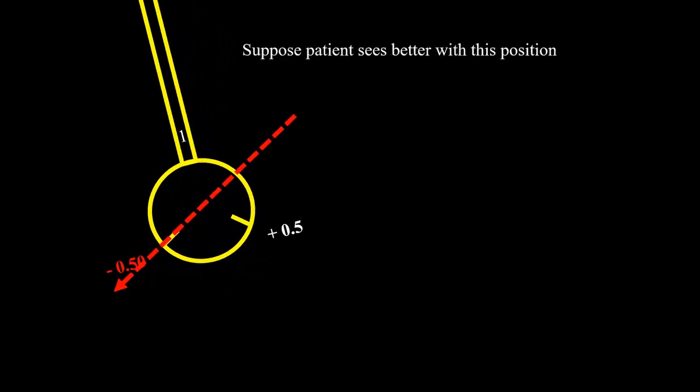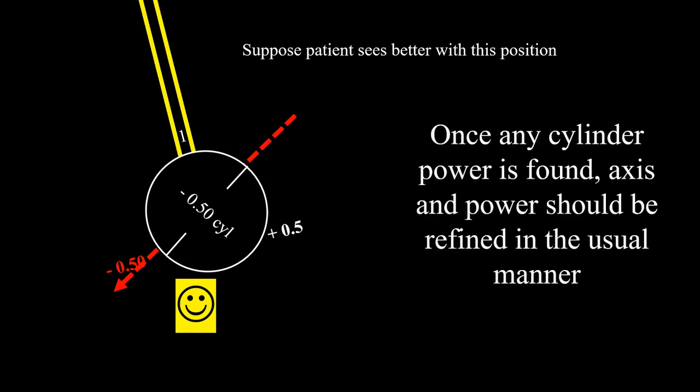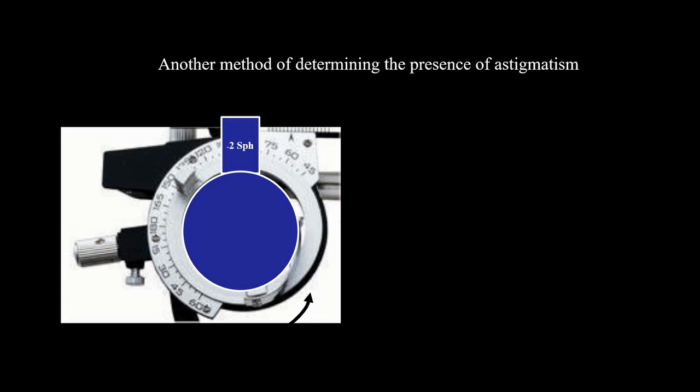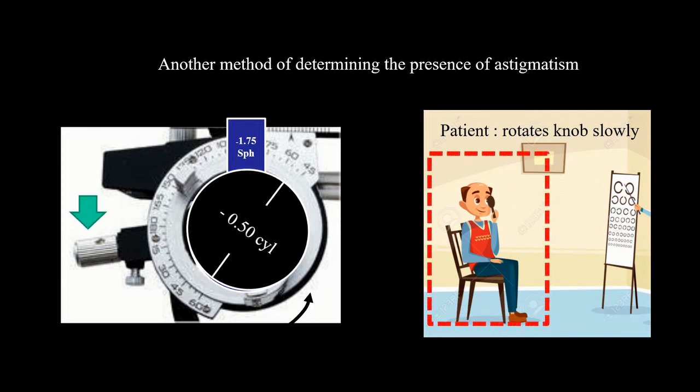Suppose the patient chooses this one as the best position. Then I'm going to take a cylinder from the trial case and put it in, and start to do what we started with, which is to check the axis, then the power, to adjust this cylinder. If we are going to start with the lenses in the trial case, we add a cylinder, change the power of the sphere by half the amount, opposite sign, then ask the patient to rotate the knob slowly to check for the best vision.